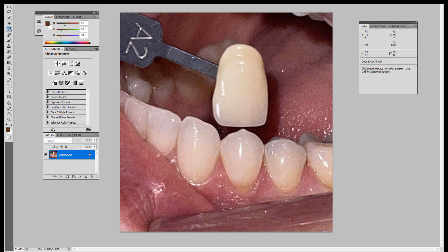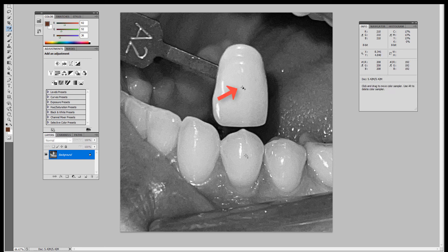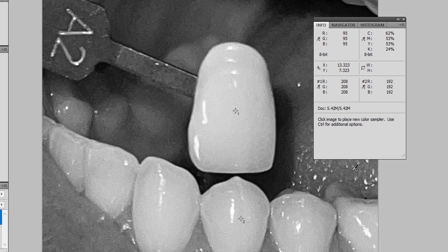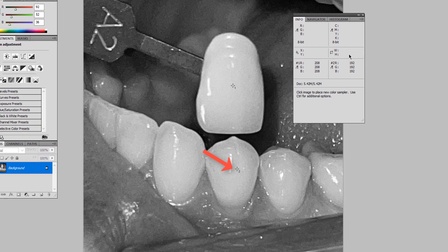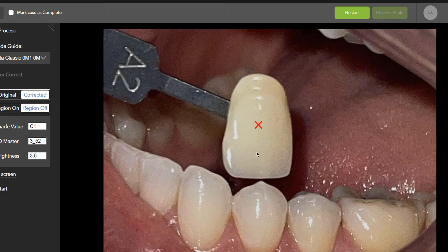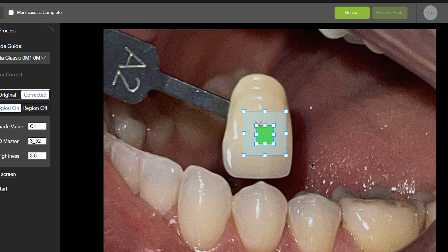To confirm, let's go to Photoshop. Here's the tooth — now we'll turn it grayscale. In grayscale, 0 is black and 255 is pure white, so the higher the number the brighter the object. Photoshop reads the shade tab as 208 and the tooth as 192, confirming the shade tab is actually brighter than the tooth. In conclusion, this can be an illusion — but when you process the image and use the green value box, you get the true degree of brightness or value.